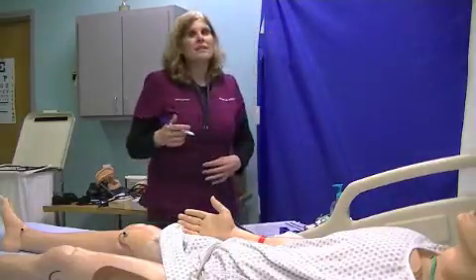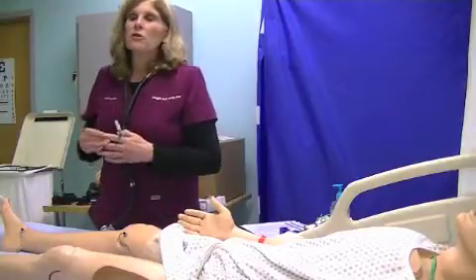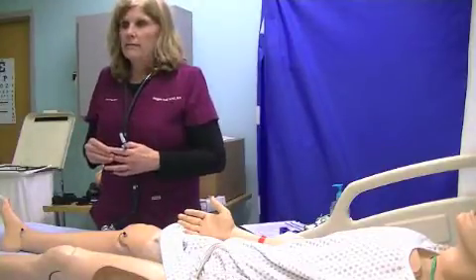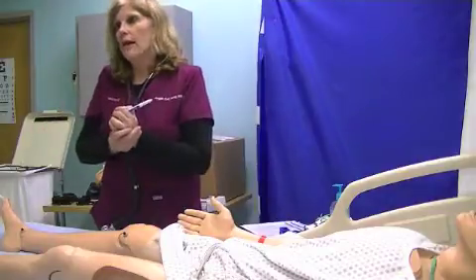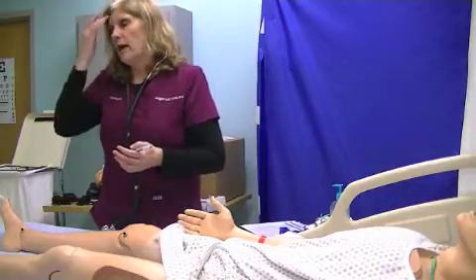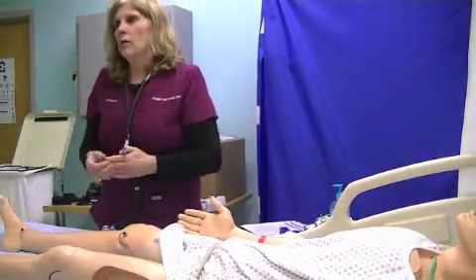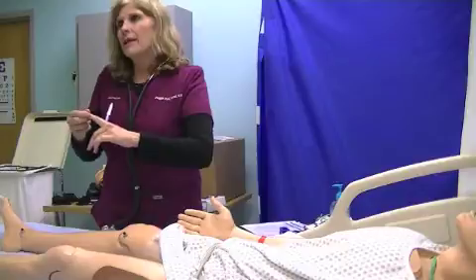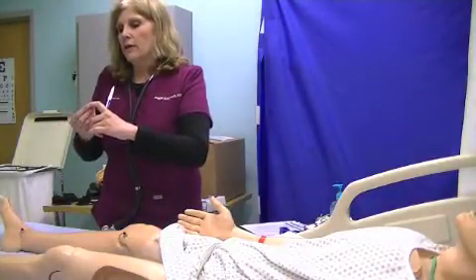There's a couple things I need to tell you about the pulse ox. If their fingers are cold, it will not read correctly. So you're going to make sure you warm the hand. Sometimes you can use a warm washcloth and put it on the hand. I do that too when I'm doing AccuChecks, checking blood sugar. So you want to make sure you get the fingers warm. Make sure the finger gets straightened out, because a lot of times some of them won't read if your finger's a little bit crooked in there.